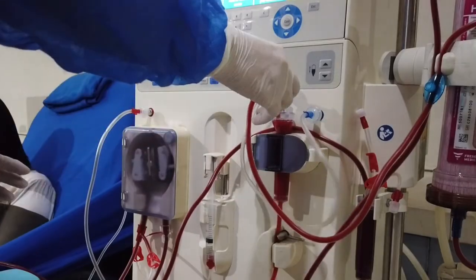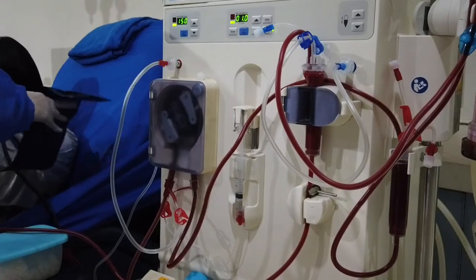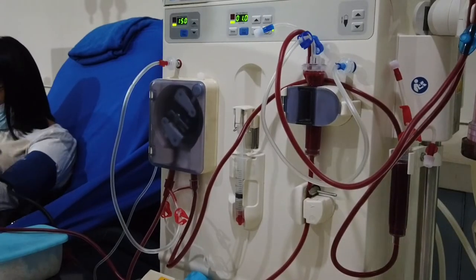Open the venous transducer clamp, then check venous pressure and troubleshoot if needed. Attach the blood pressure cuff to the patient's arm.